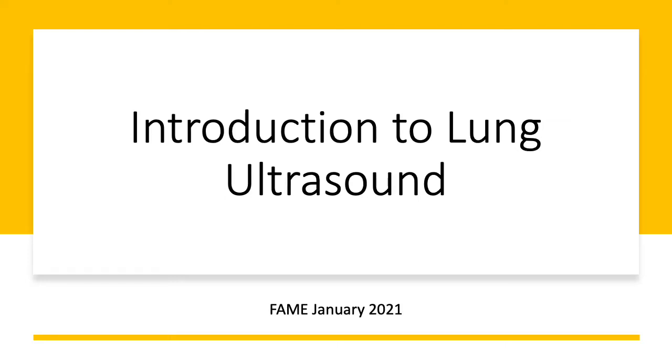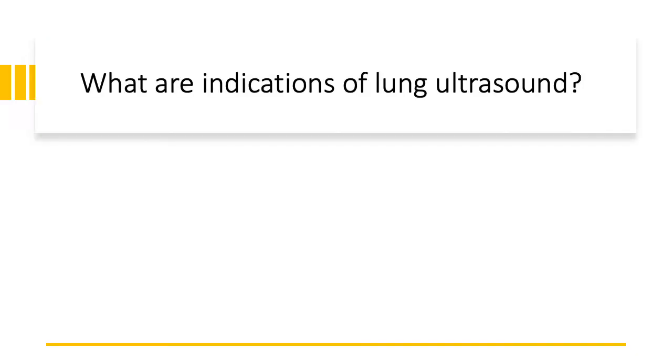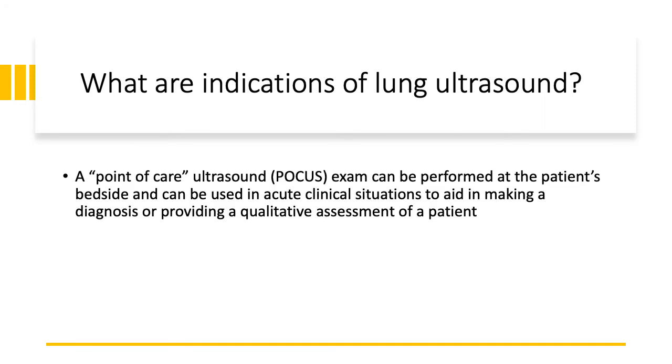Today we will do an introduction to lung ultrasound. So what are the indications of lung ultrasound? Point of care ultrasound, otherwise known as POCUS, exam is nice because it can be performed at the patient's bedside and can be used in acute clinical situations to aid in making a diagnosis or providing a qualitative assessment of a patient. It's also nice to use as a quick preoperative exam.